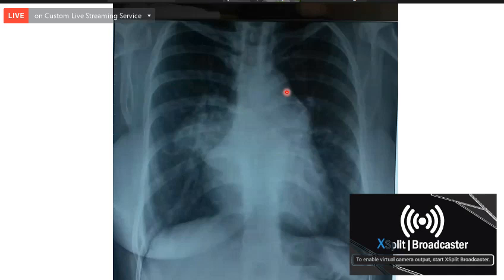MPA looks dilated. Yes, MPA is dilated. Very good. RPA, LA. LA appendage normal, sir. The LA appendage is not dilated. Very good. And with the LV type of apex. And the cardiothoracic ratio is approximately 0.5. Yes, it is by visual assessment. It's about 0.5. Very good.